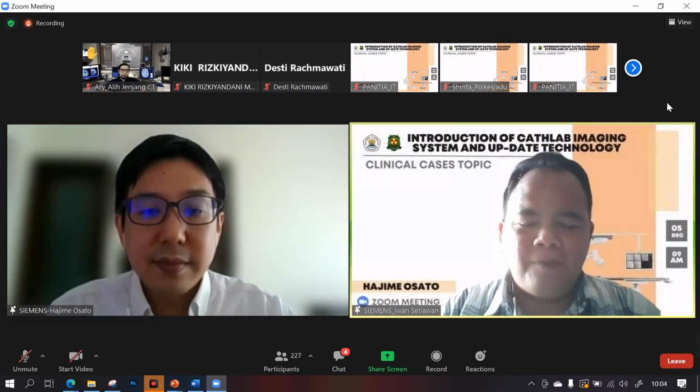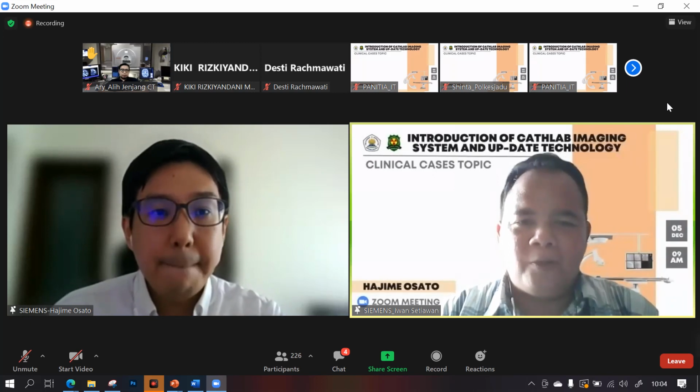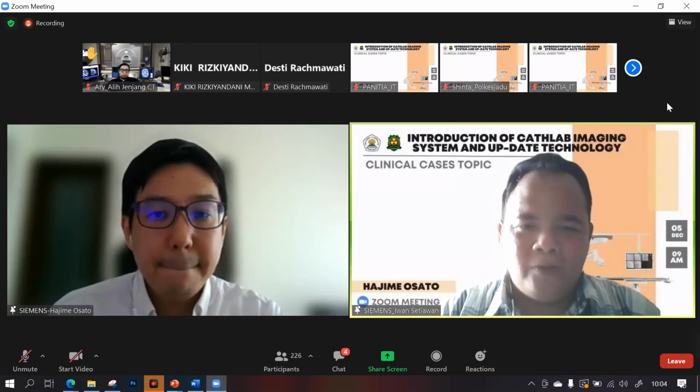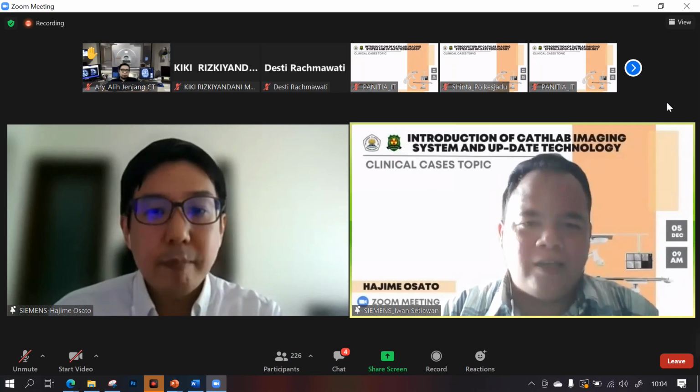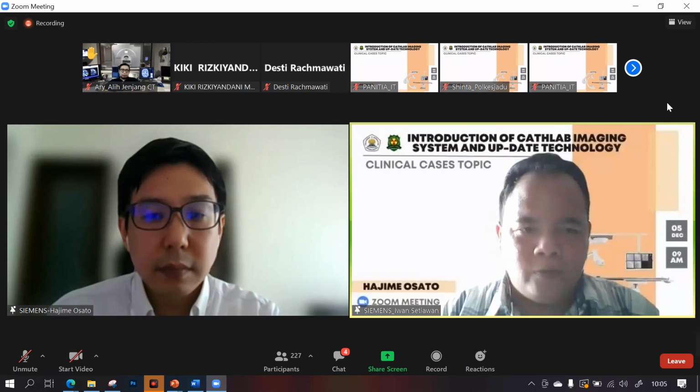Okay. Yeah, because maybe, as you know, after stent implant, the doctor will request a high resolution image, and sometimes they think this is possible to do with the same technique on the Artis Zee system, Hajime-san.